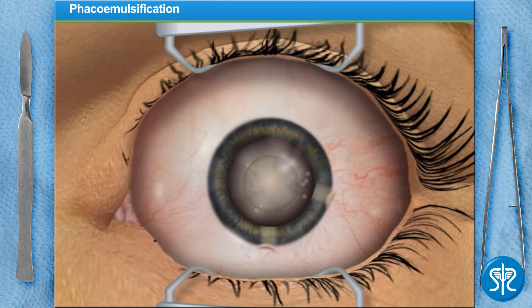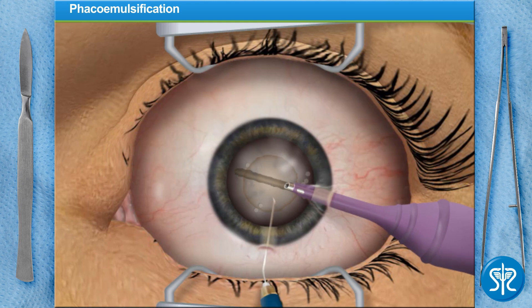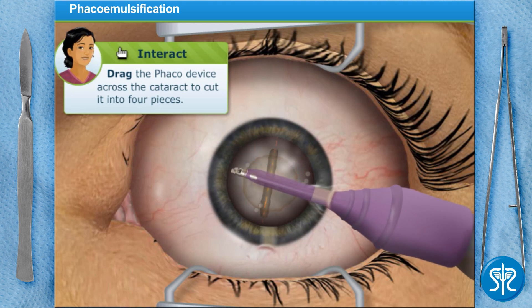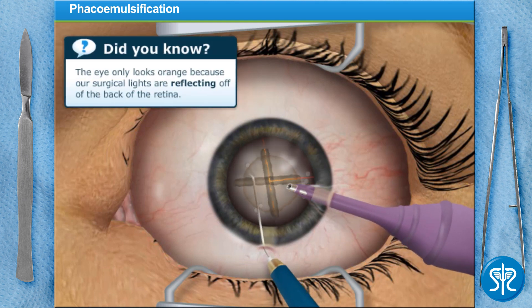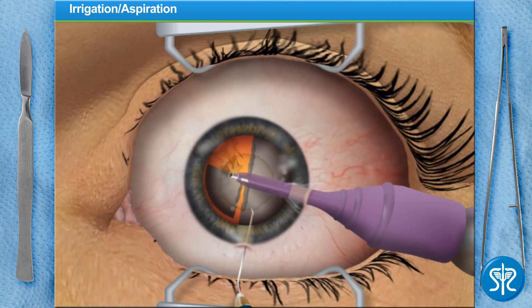We'll now perform phacoemulsification, or phaco. This is done by using ultrasound to break up the affected lens so it can be removed from the eye. To do this, we pulse and drag the device to cut across the cataracted lens. We repeat the phaco from the other direction to create four pieces. The phaco is then used to suction out the pieces of the old lens.